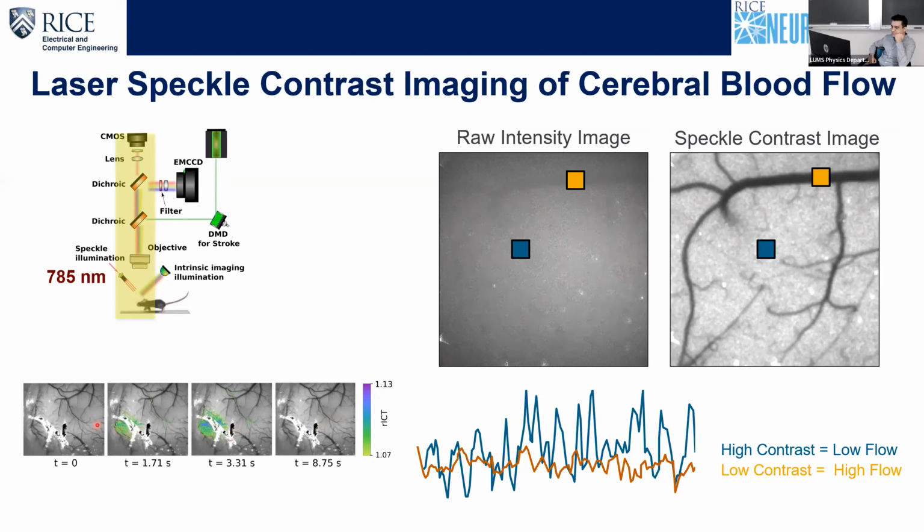Here, the way we are showing this transition is we're capturing images at 70 FPS. So there are thousands of images being captured, and I'm just showing 4 of them over here. Four of them, yes. Okay, I got the point. Okay. Thanks.